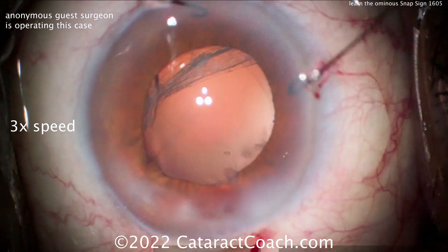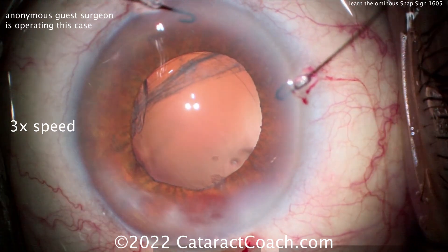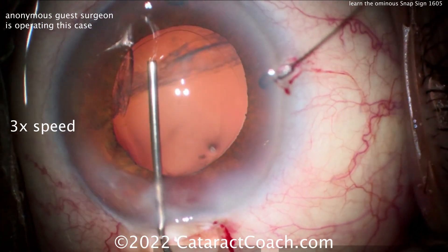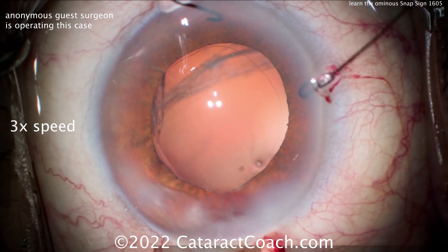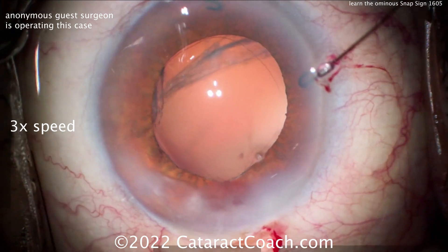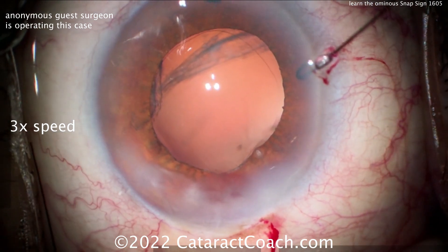The better part of judgment now is to clean up as best you can. Take out any remaining lens material and cortex that's there, clean up any prolapsed vitreous, and send the patient to the retina surgeon. Should you put an IOL in and do an anterior vitrectomy now? It depends on your situation. If you think there's a good rhexis, which looks like there is here, you can do an anterior vitrectomy, clean everything up, put a sulcus lens in with optic capture, suture the incision, and have the patient see the retina specialist. Or you can send the patient to the retina specialist as is — aphakic — and let the retina specialist take out the nucleus, do the full vitrectomy, examine the retina, and then put in the secondary IOL with the fixation of your choosing.